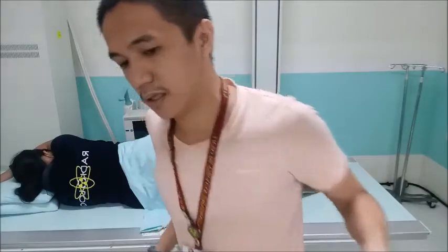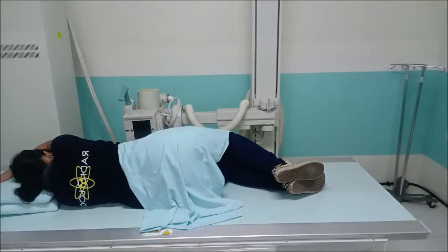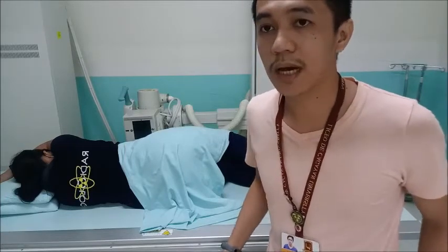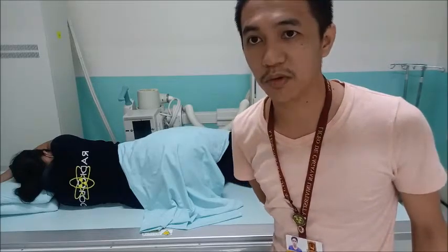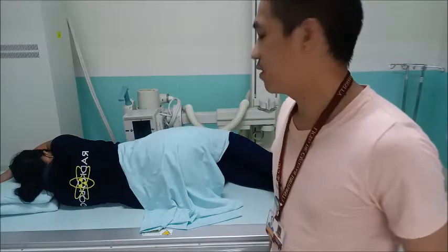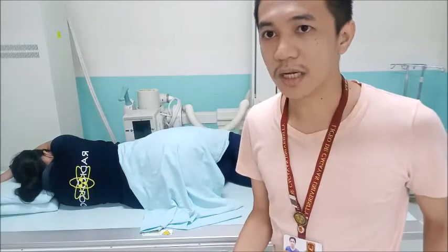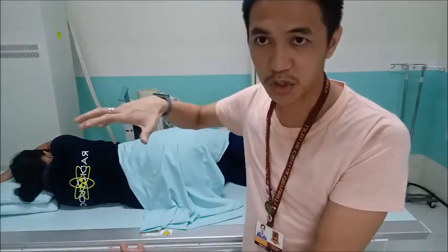For the upright positioning, if the patient has been lying down for some time, then you have to allow the patient to sit up for approximately 15 to 20 minutes before you take the upright exposure. And if the patient has been standing or sitting up, then you can take the decubitus positioning right away, positioning the patient toward the right lateral or the left lateral side, based on the condition of the patient, which side is affected.